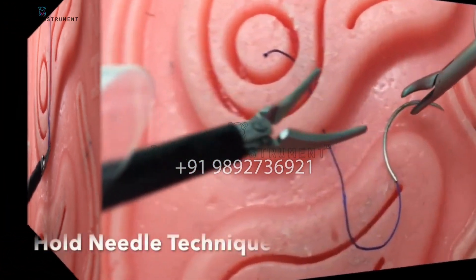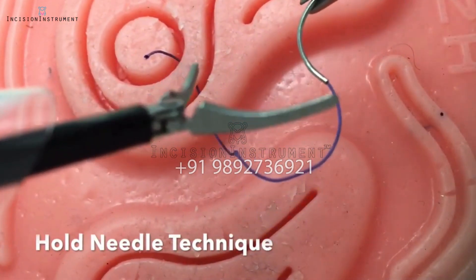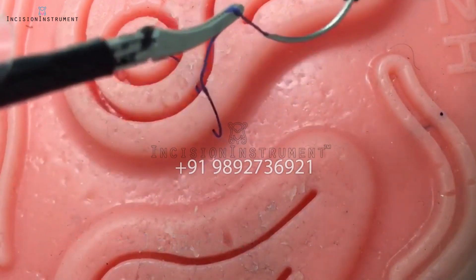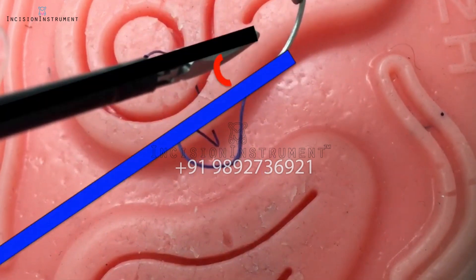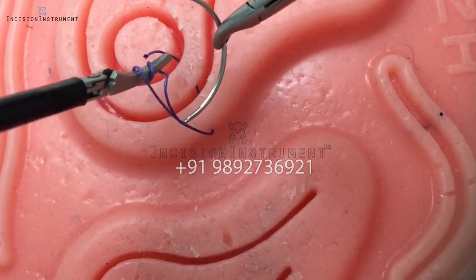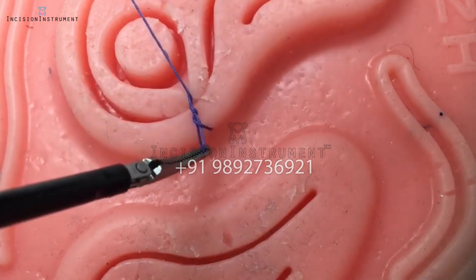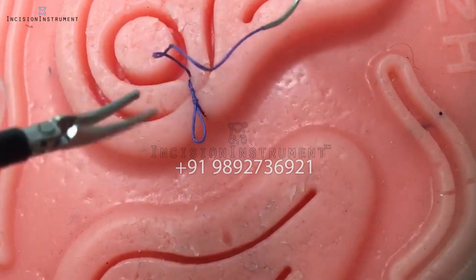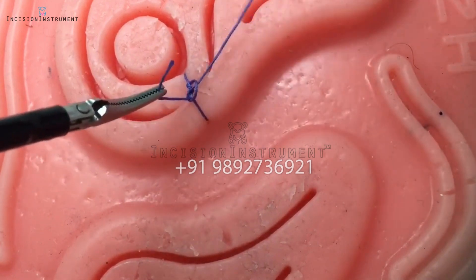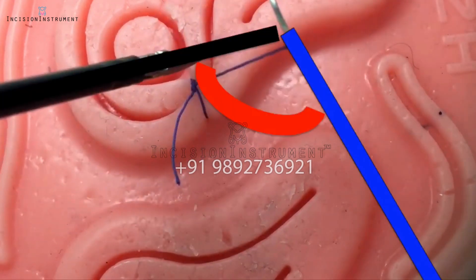The next technique is the hold needle technique. This technique may be beneficial with shorter sutures. In contrast to the drop needle technique, here the needle is constantly held. The key principle is to rotate the needle to line up with the suture and to minimize the instrument to suture angle. By creating this almost parallel angle and utilizing the sturdiness of the needle, wrapping your suture around your left instrument becomes virtually effortless. Remember to alternate your throws by placing your left instrument on opposite sides of the suture, and always rotate the needle to line up with the suture to minimize the instrument to suture angle.